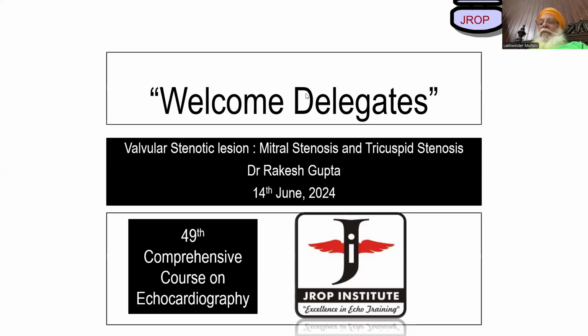We have come a long way in understanding the basics of M-mode, 2D, and Dopplers, followed by chamber quantification and measurements. Now, what we are going to see is the clinical application of all this, which we have learned in the last almost 4 lectures, followed by an examination. Today, I'm going to deal with a few of the stenotic lesions, that is mitral stenosis and tricuspid stenosis.